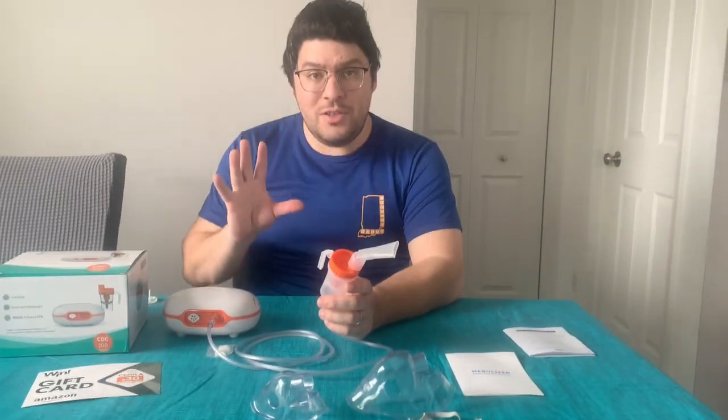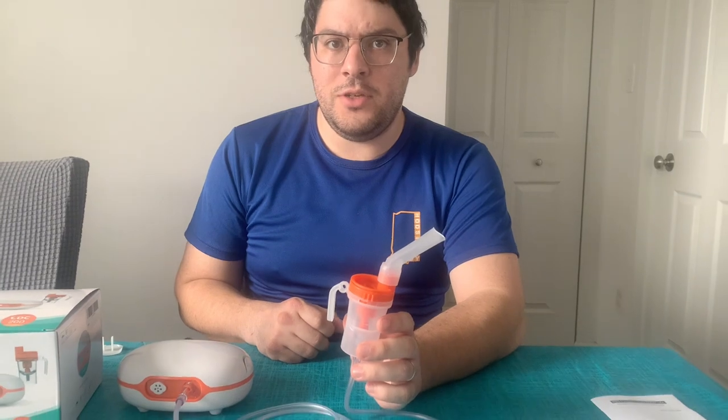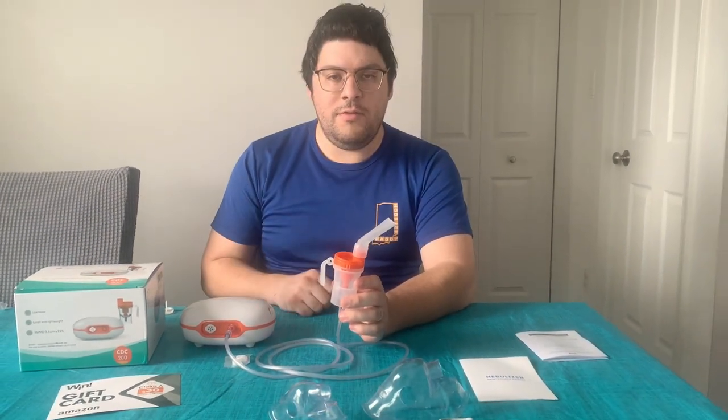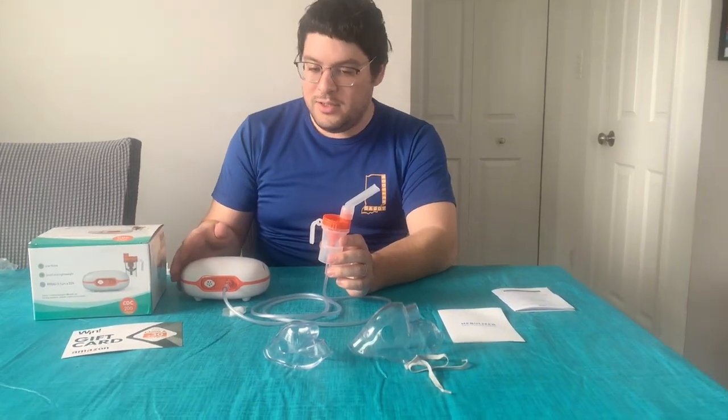Just to show you how quiet this unit actually is, let me go ahead and turn it on for you. I can talk normally and we can have a conversation and you can hear me just fine. So if you're looking for a portable, lightweight, small nebulizer that's not very loud, check this one out.